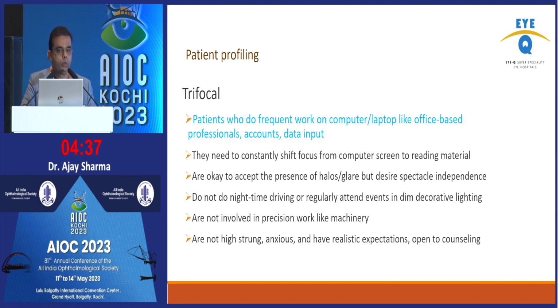So patients who do frequent work on computer or laptop, like office-based professionals, accounts and data inputs, constantly need to shift focus from computer screen to reading material. All these are the patients to be counseled for trifocal lenses, and they are not involved in precision work like machinery, because very near work, even with the best of trifocal or multifocal lenses, will be very difficult, because near vision can't be perfect here.